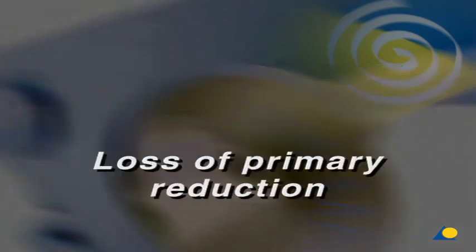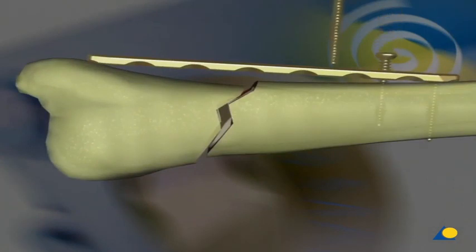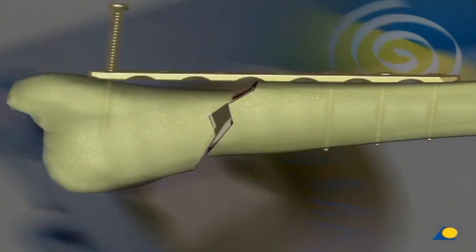Loss of primary reduction. When using conventional screws, it is essential that the plate be adapted exactly to the bone surface. Otherwise, tightening the screws can cause the loss of primary reduction.